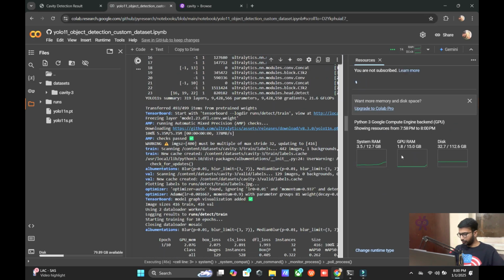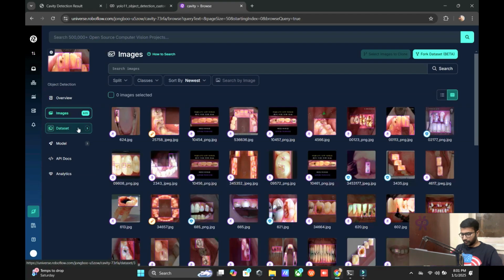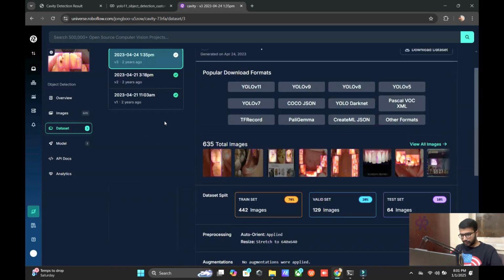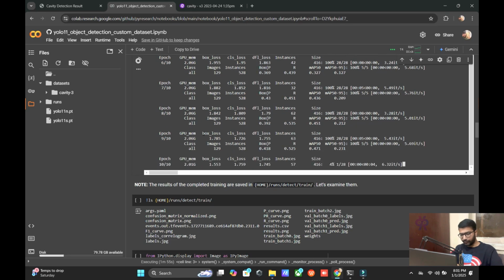And you can see the GPU is utilized at 1.8. You can see here multiple datasets are available. If you want to use them, you can. And here, with the disease type and cavity detection, we are targeting only cavity. So it's the initial phase of exploring healthcare with detection. First of all, we build our audience trust and also make possible projects and understanding.